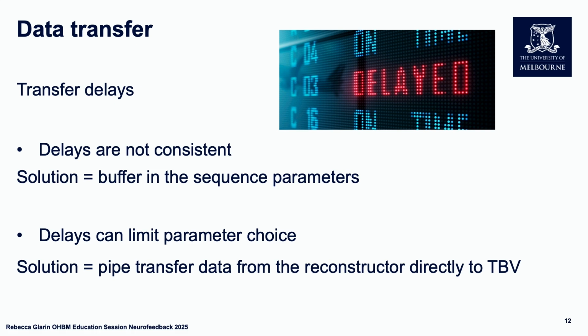And with that, I should have said with your computer, try and get it set up for exactly what your software version suggests. So the same CPU, the same GPU, that sort of thing. And that will help with the potential delays. And also changing the size of your ROI. I don't know if anyone's mentioned that, but the bigger your ROI, the longer your calculation will take. So if you're finding noticeable delays, you can consider altering that, or you could lower your spatial resolution and have the same size ROI. So there's ways you can move around that.